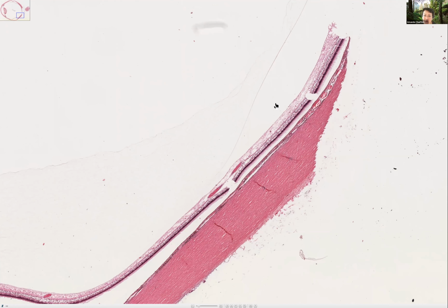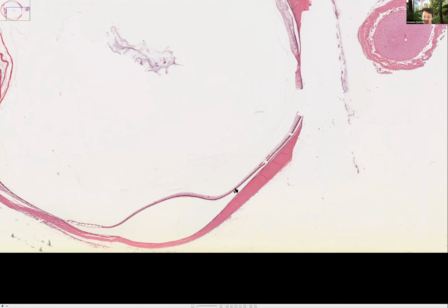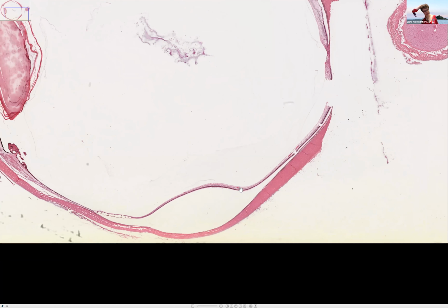Although your eye is attracted to look up here at this thickened wiggly part, I think the best areas for seeing the necrotic changes are actually on the inferior side down here when you're looking at the slide yourself. So this is an unusual slide because we don't get these as histologic specimens. All right, so I don't have any more learning points from this. Do you, Amanda? Have we been through all of the things?